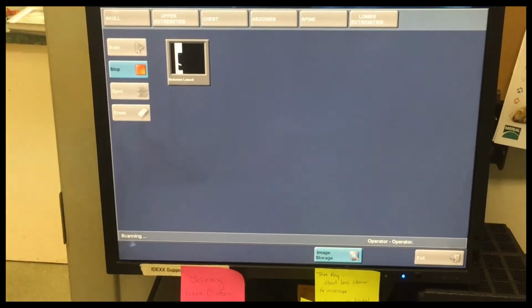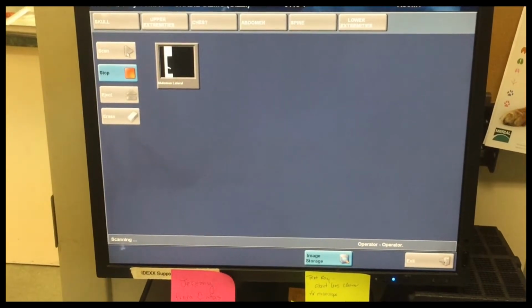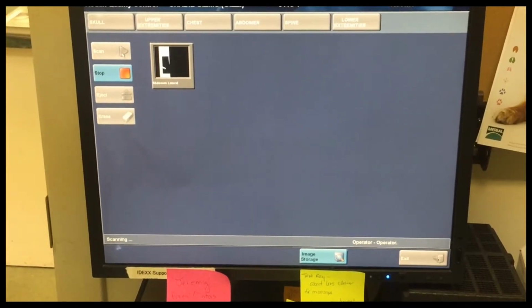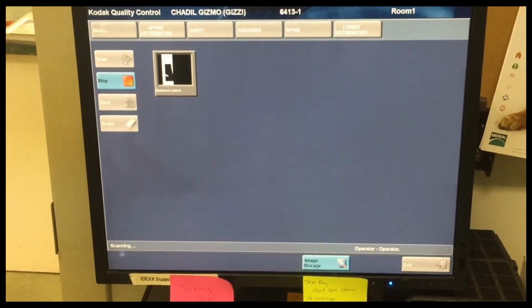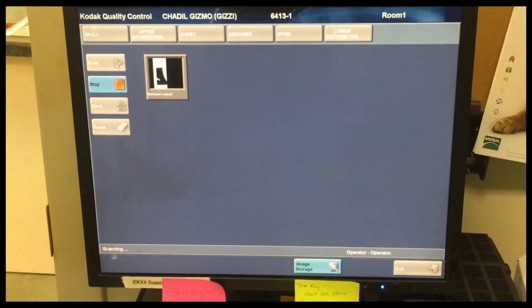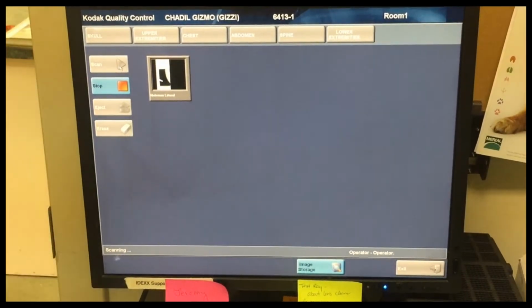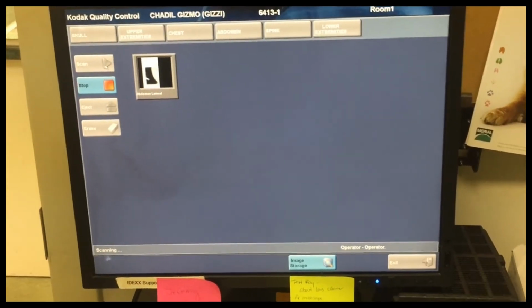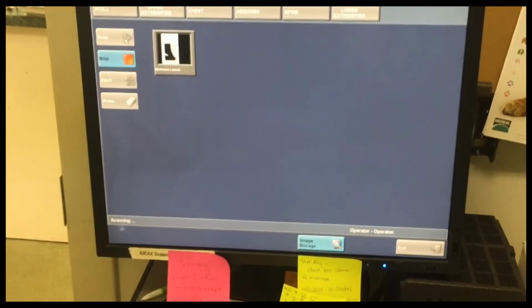At the end, you want to evaluate the size, shape, and location of the GI structures. Evaluate transit times and use references for normal times. Evaluate intestinal patency. Look for repeatable focal narrowing of the lumen or contrast agent column. Look for a space occupying lesion.